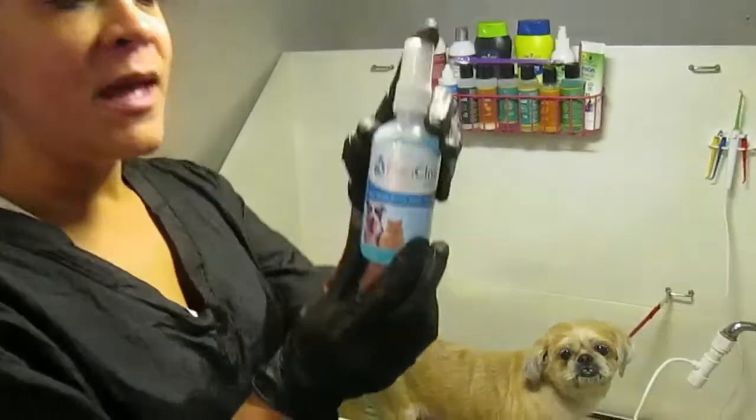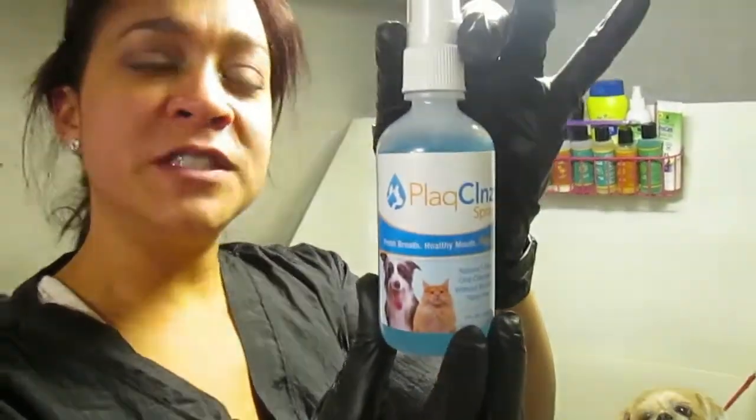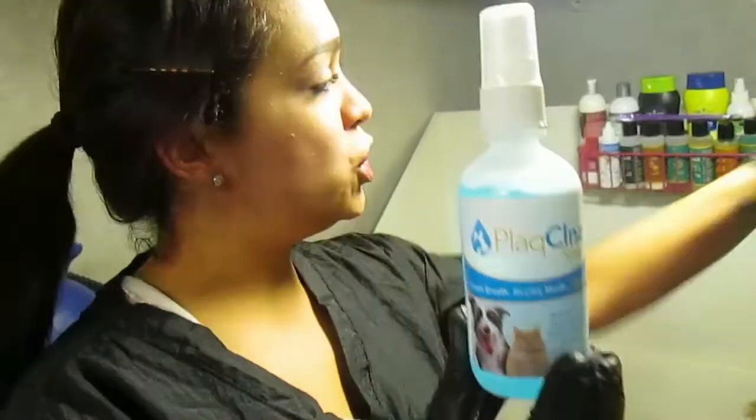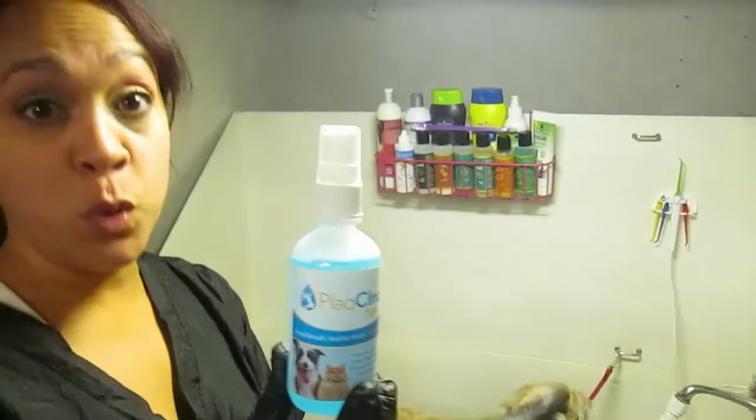Alright everybody, we are about to start. I'm going to show you the very first step — this is the spray. What it does is soften the plaque, so when you use your machine it's softer and easier to remove.